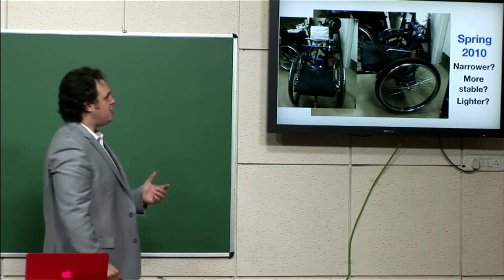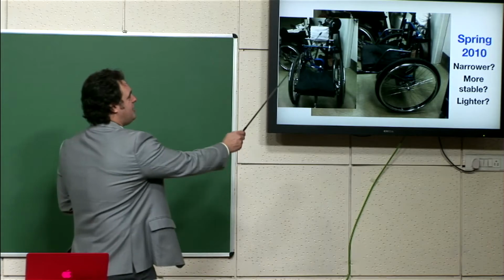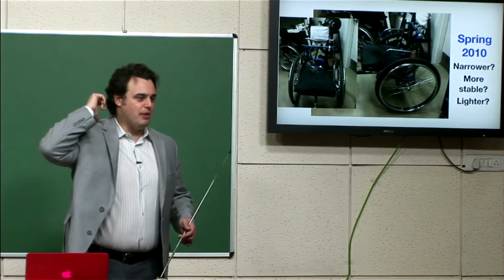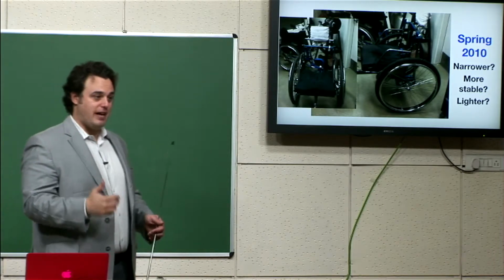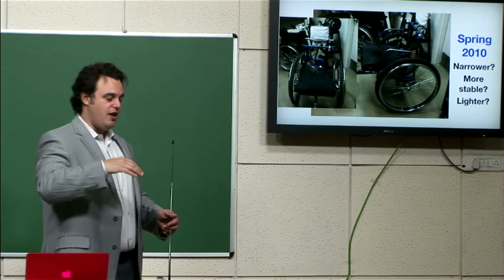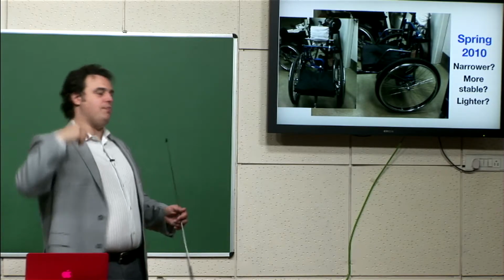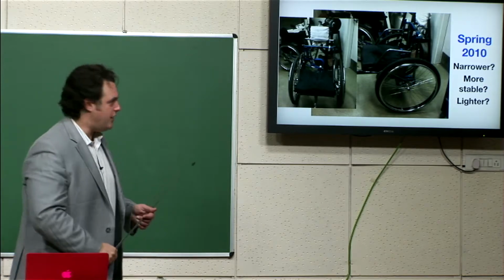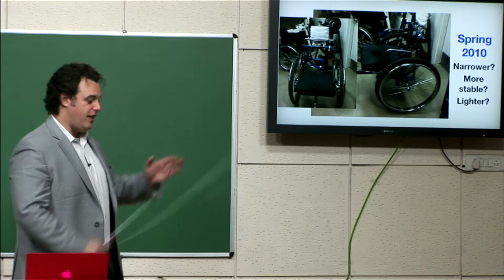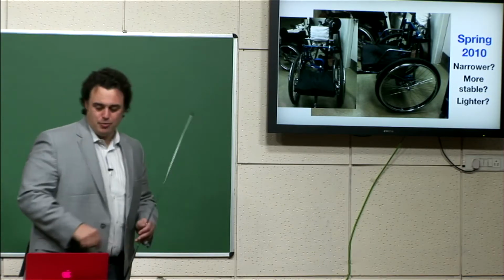The second innovation that's in this very simple prototype is we had a seat back that we added. And this seat back supports you between your shoulder blades. It acts almost like a bench press bench. Like when you lie on a bench press bench, the bench is doing this same function of providing a reaction force at your shoulders. Right? So your back doesn't bend backwards when you're benching. So it's much higher than a normal seat back on a wheelchair, and it's much narrower. It almost looks like a headrest, but it goes right between your shoulder blades.